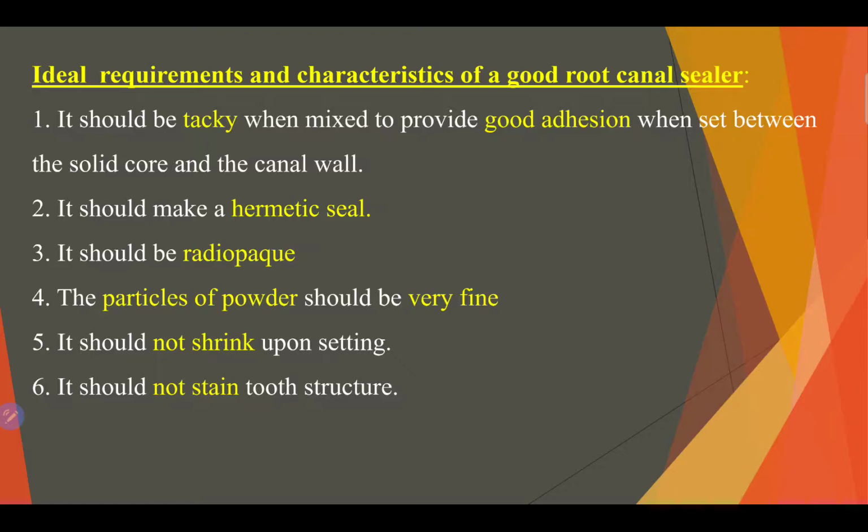I have another video about the adequate consistency of the sealer, which is important, about the string out test. So if it's not tacky, when you do the string out test, it will not stick, and it will not make the string which we talked about before.